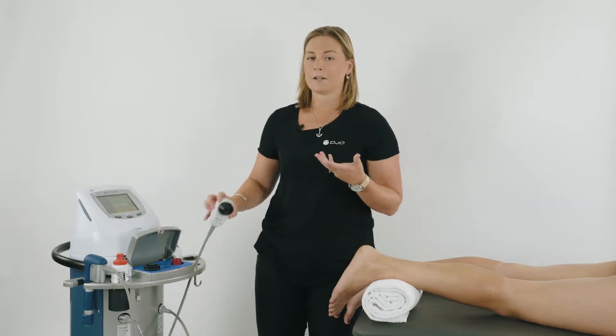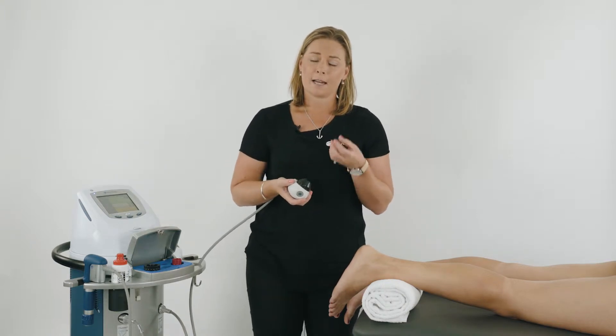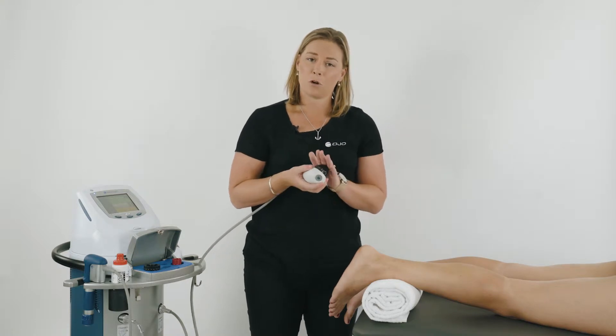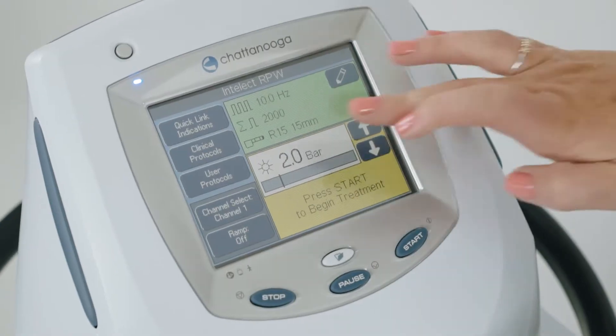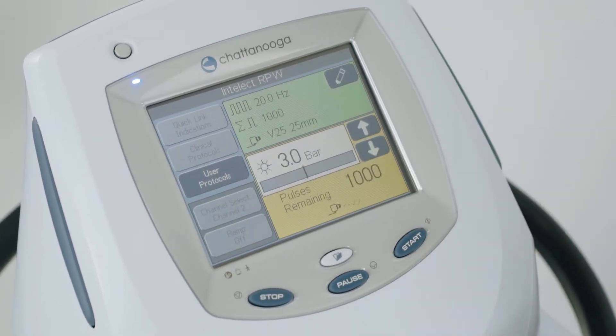We can use the V-actor to start the treatment. What's really good about the V-actor is it helps to desensitise and it acts as a massage tool. We don't use any gel with this head — there's no shockwave coming out. Make sure you select channel 2 on the machine and you're ready to go.